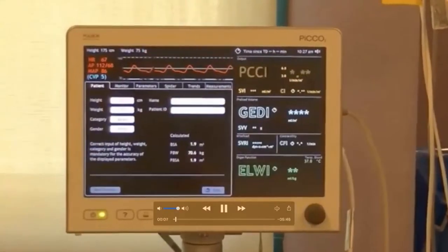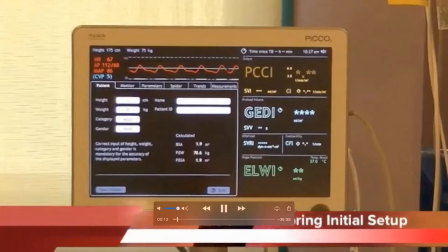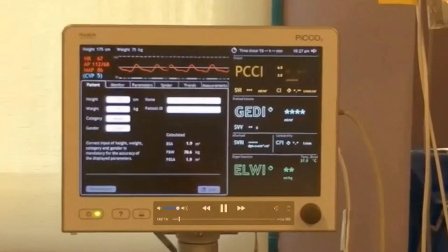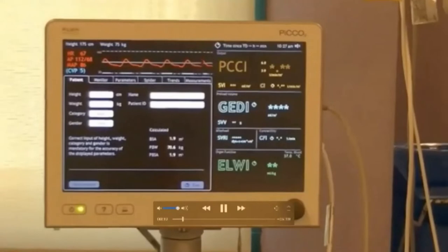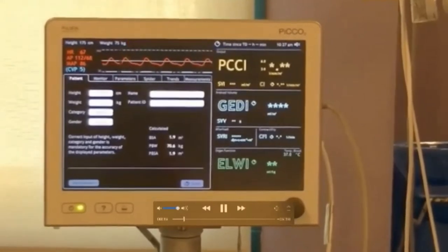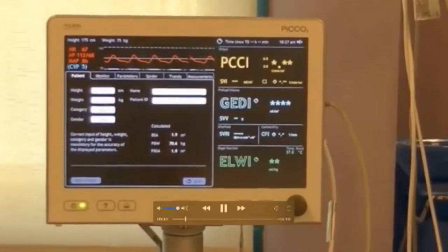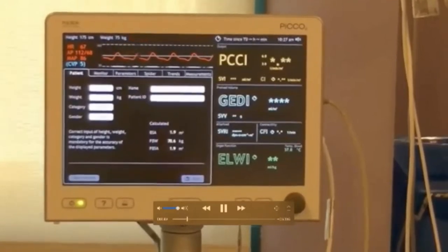This presentation will show you the basic preparation and setup of the pulse contour cardiac output monitor, or the PiCCO monitor. PiCCO is an advanced hemodynamic monitoring that gives a complete hemodynamic picture without a pulmonary artery catheter. It provides information such as continuous cardiac output, volumetric preload and afterload, contractility, volume responsiveness, and pulmonary edema or lung water. This video presentation will not discuss detailed information as to what PiCCO can do and its indication. What will be discussed are supplies that would be needed for monitoring and how to initially set up to begin hemodynamic monitoring.